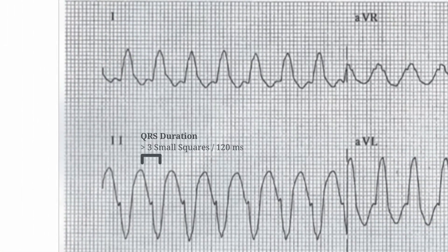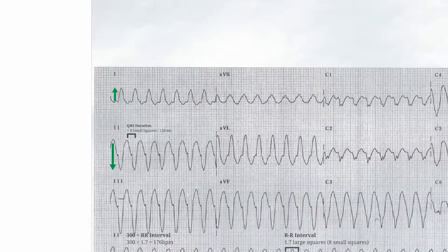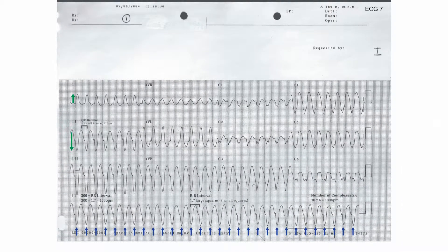The axis is widely left axis deviated, with a completely positive complex in lead 1 and a completely negative complex in lead 2. There are no obvious P-waves present, and therefore it's impossible to comment on the P-waves themselves or the PR interval.